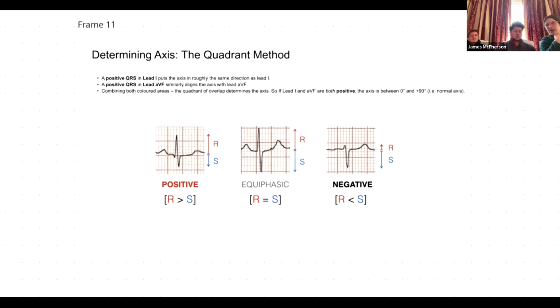Yeah. Is there also just natural variation between individuals? Like, will some people have a kind of left tilted heart and some people more vertical? Yeah, absolutely. And although you might see minor left and right axis deviation, you won't see significant or extreme left or right axis deviation, because that's normally a sign of something else, like one of these examples that we're talking about, rather than a normal variant for someone. Right.